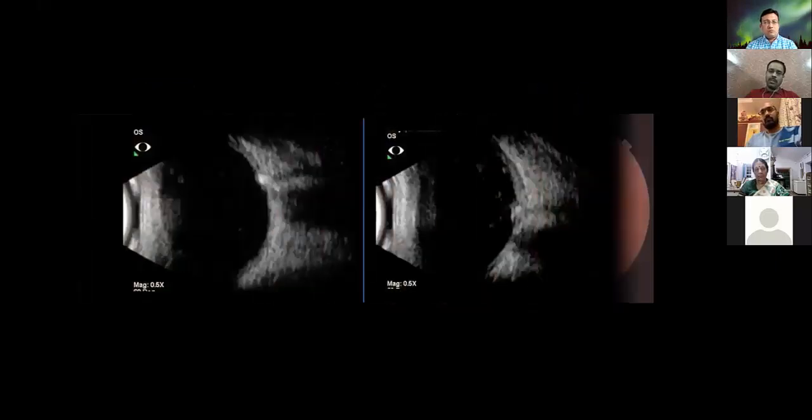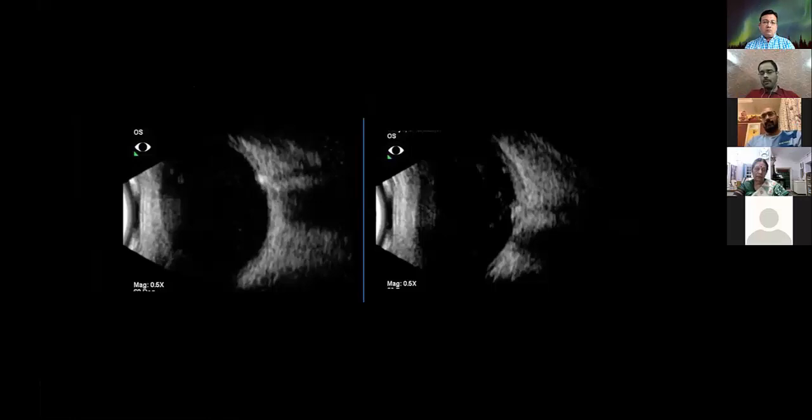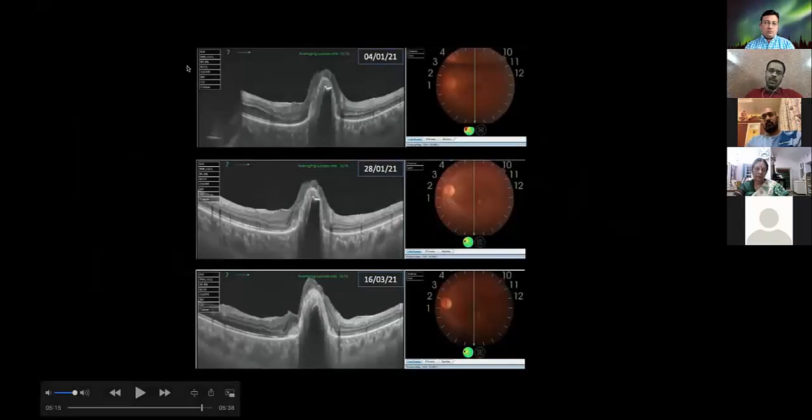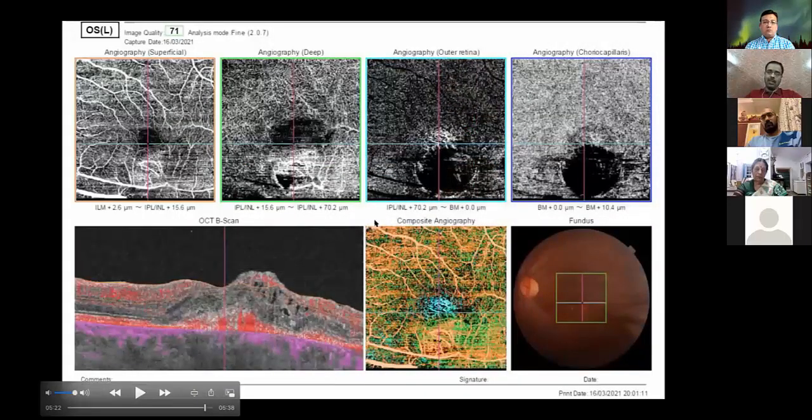Going on to the B scan. On the left is the pre-op B scan, which shows the foreign body. This is post-op about day 15 after the surgery, showing that the foreign body is still there. The echoes surprisingly seem to be coming from the anterior surface of the retina, but there was no foreign body localized there. On further proceeding, I tried to do the OCT, and one can see a sliver-like foreign body in the subretinal or the sub-RPE space, subfoveally. The last OCT does show some amount of choroidal neovascular membrane that's developing and involving the subfoveal space. The angio OCT done on the last visit, yesterday, does show a CNVM subretinally.